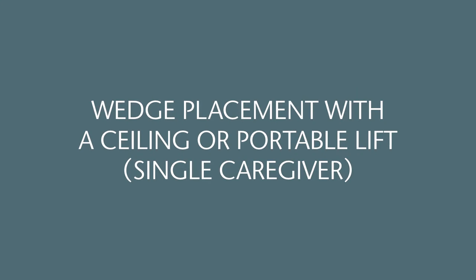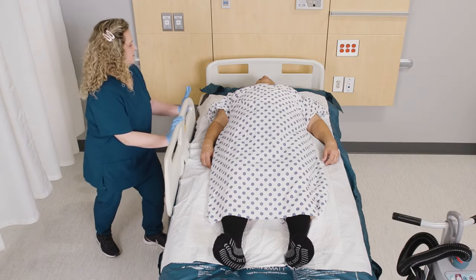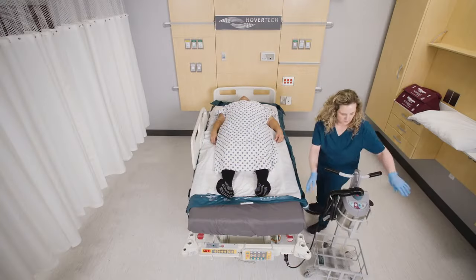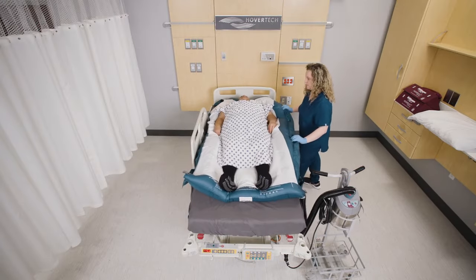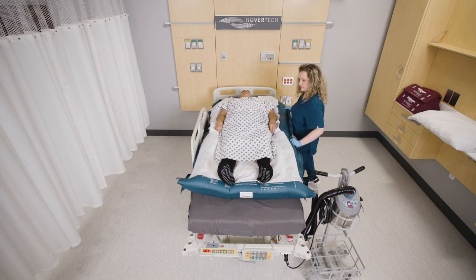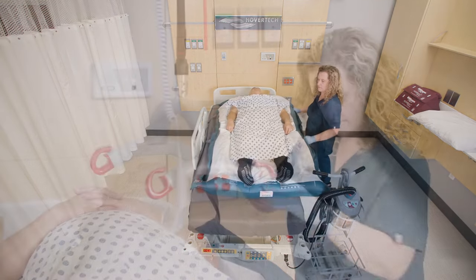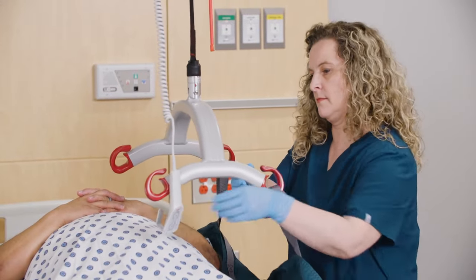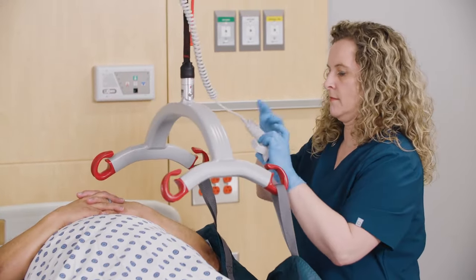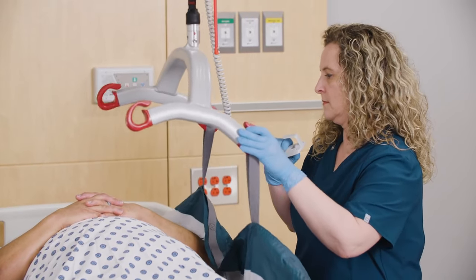Wedge placement with a ceiling or portable lift — single caregiver. Raise the side rails on the opposite side of the bed from the direction the patient will be turned. Ensure the patient is centered and slide the patient as close to the edge of the bed in the opposite direction of the turn. This will allow the patient to be centered on the bed when repositioning on the wedges. Attach the shoulder and hip turning straps of the Pro's AIR to the hanger bar, which should be parallel to the bed. Raise the lift to initiate the turn.